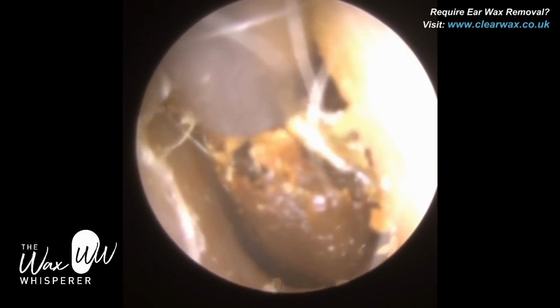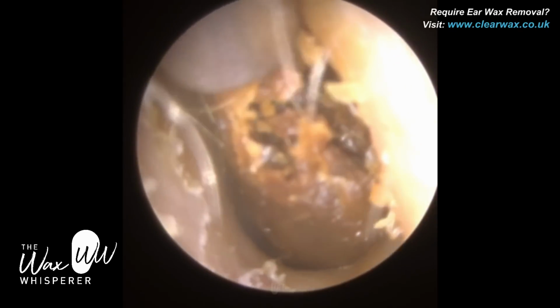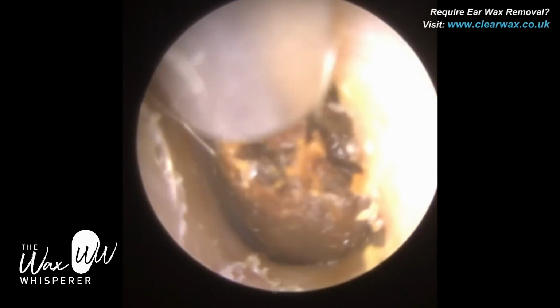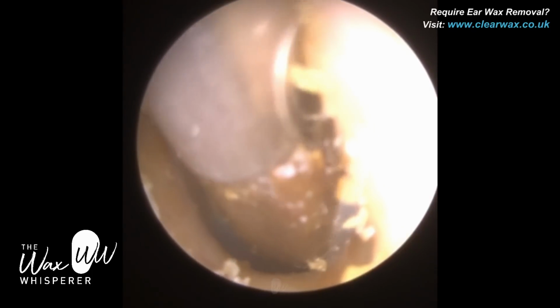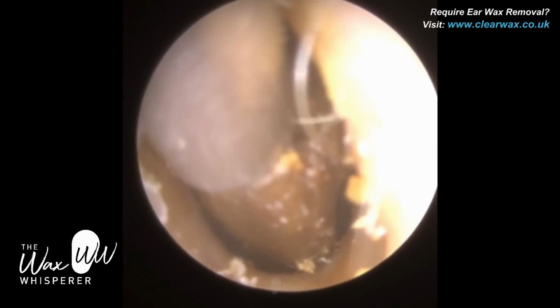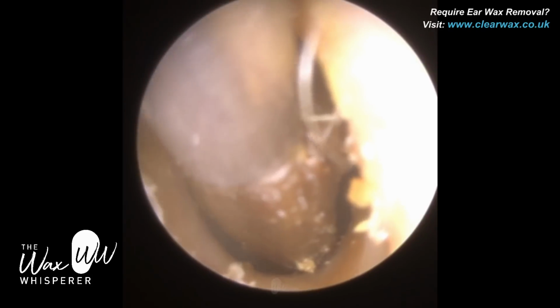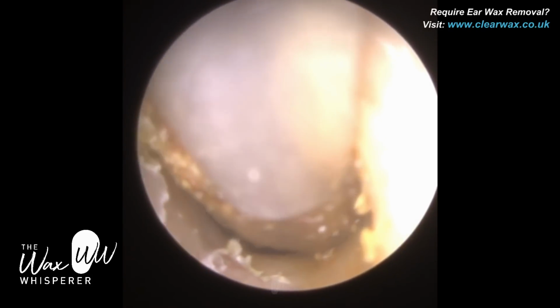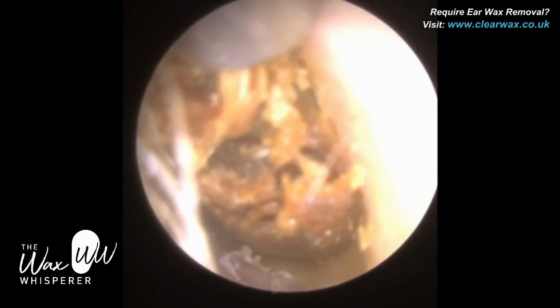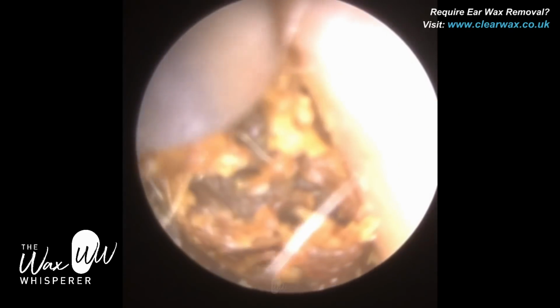So in America, we call it rugby. Well, there's two different sports, but a rugby ball compared to a football or soccer ball is more round. But the ear canal takes the shape of more of an American football or a rugby ball. It's more elongated, more like an egg shape. So it is quite large, and you can just see how narrow the ear is.